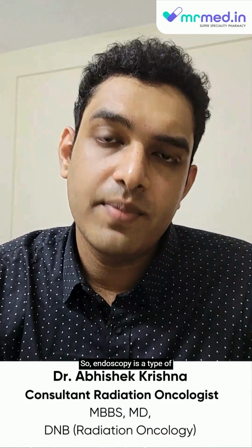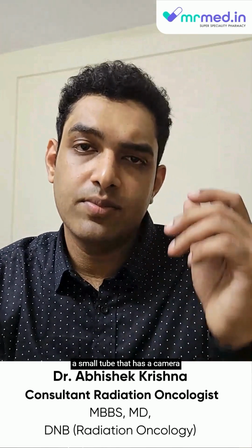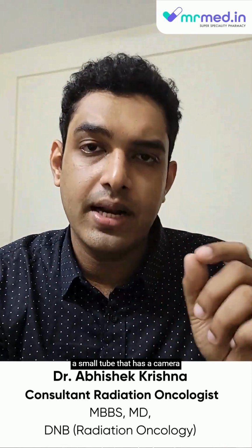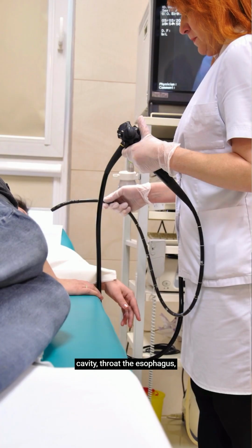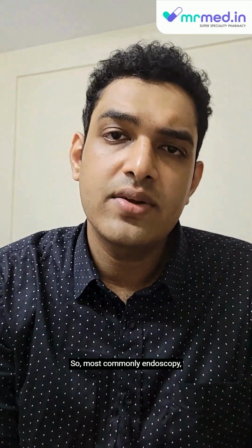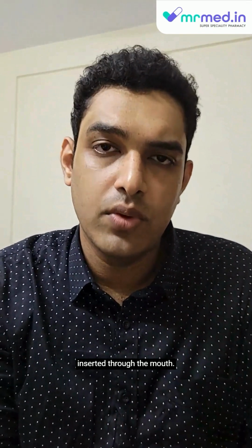Endoscopy is a type of minimally invasive diagnostic procedure in which we insert a small tube that has a camera at the end of it, either through the mouth to visualize the oral cavity, throat, the esophagus, the food pipe, the stomach, etc., or to visualize the colon and rectum. We insert the tube through the rectum. Most commonly, endoscopy is synonymous with upper GI scopy, where the tube is inserted through the mouth.